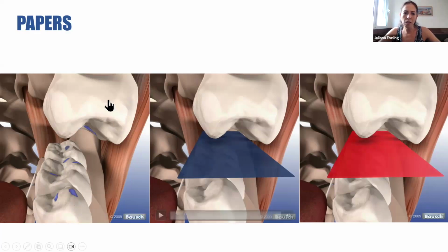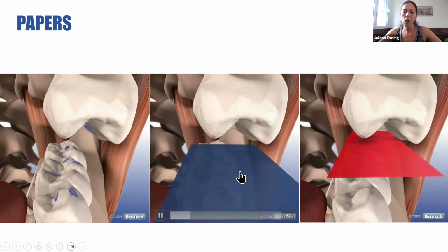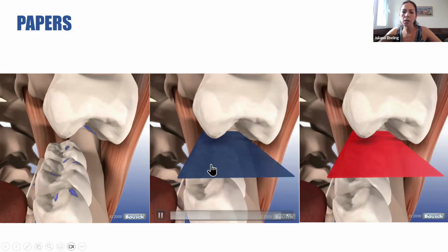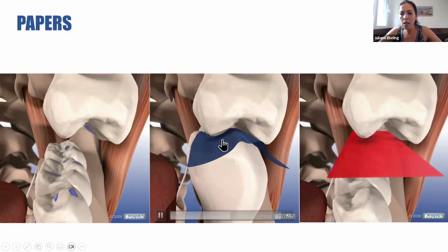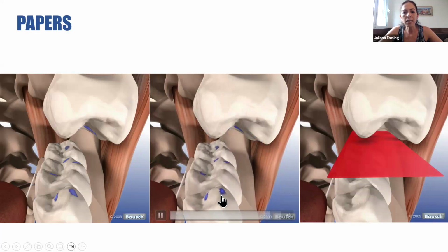But when we go to the same occlusion with a 100 micrometer paper, look how it models the teeth and the occlusal anatomy better because it's thinner, and we have more detail, or more refined contact, because I have a thinner paper that transfers this glue and this ink.